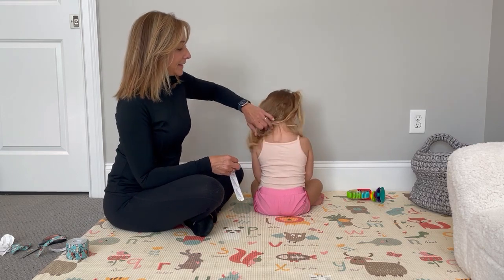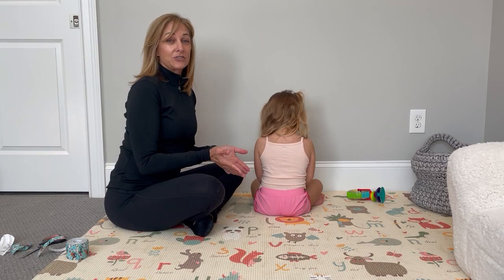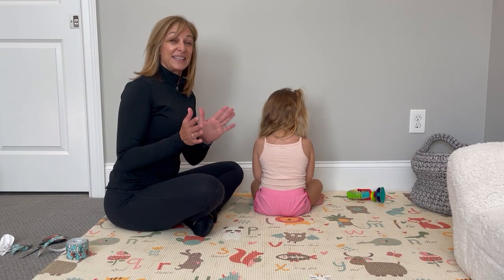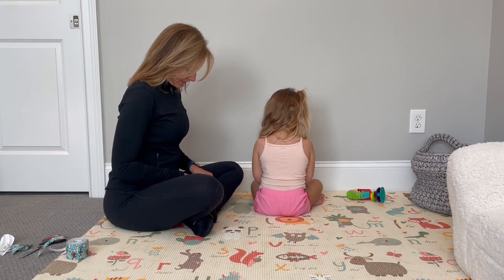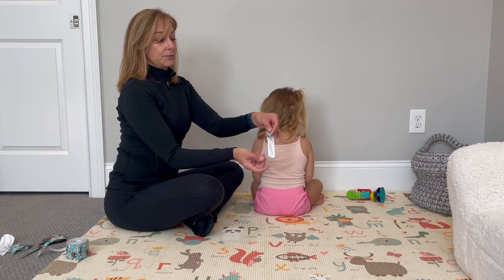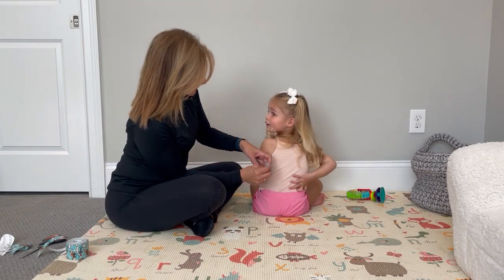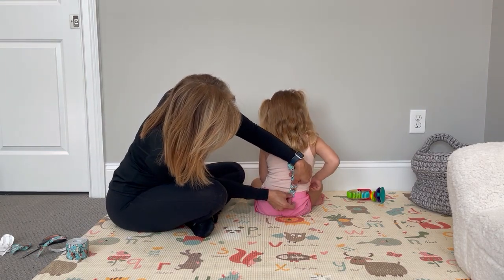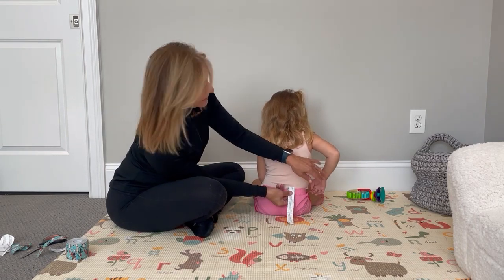And luckily for me, I have Camden who's able to sit up really straight. But as you may imagine, if your patient wasn't able to sit up straight, you would probably need a parent or a second helper to hold them or keep them sitting up straight. Then all you've got to do is a little anchor at the bottom. Not there. I'm going to start right here above her sacrum. Rub the tape. Now you would put it directly on the skin.